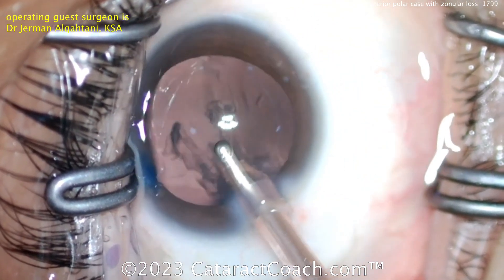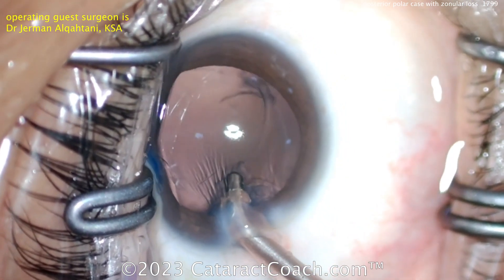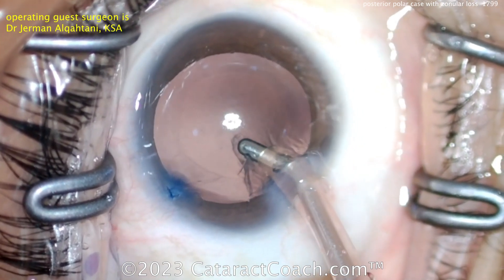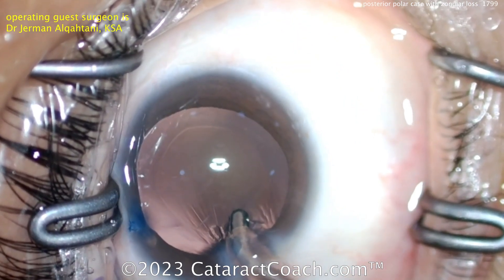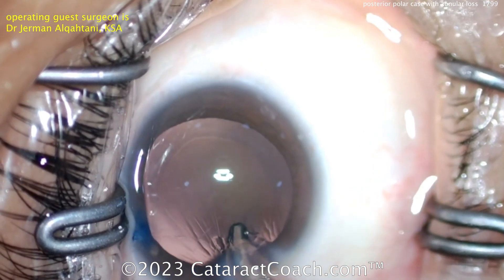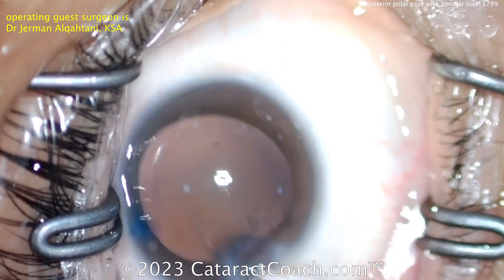Right here I would not let the anterior chamber collapse. When you take this last piece of cortex out, with your non-dominant hand get that viscoelastic and fill the capsular bag to avoid collapsing it, because in posterior polar cases collapsing the bag could be enough force to rip the posterior capsule open if there's a pre-existing weakness or defect. A little sub-incisional material here coming out.